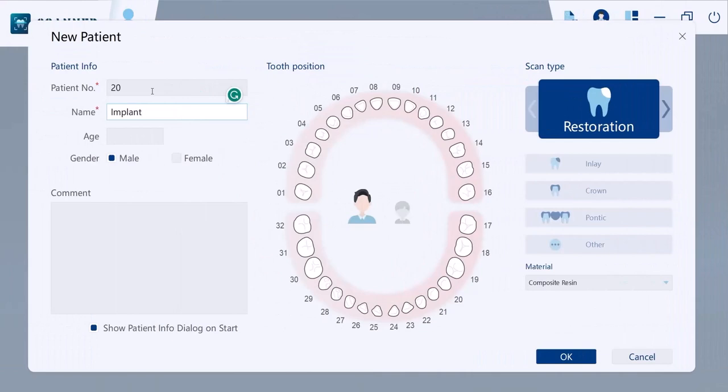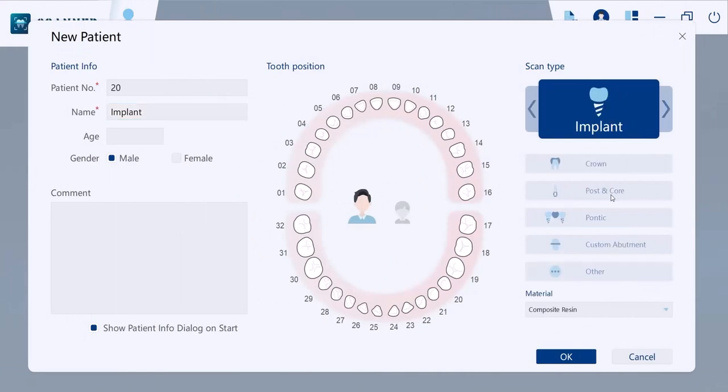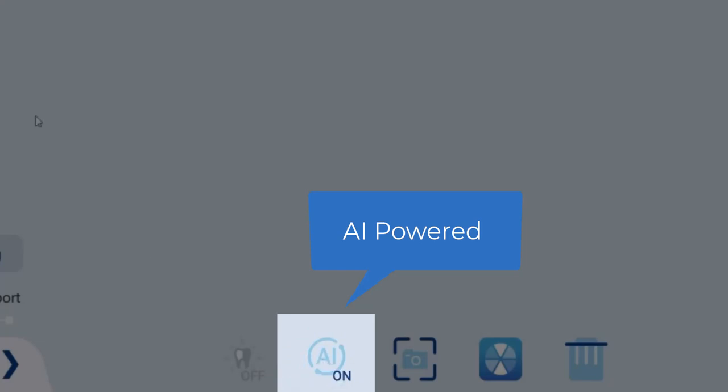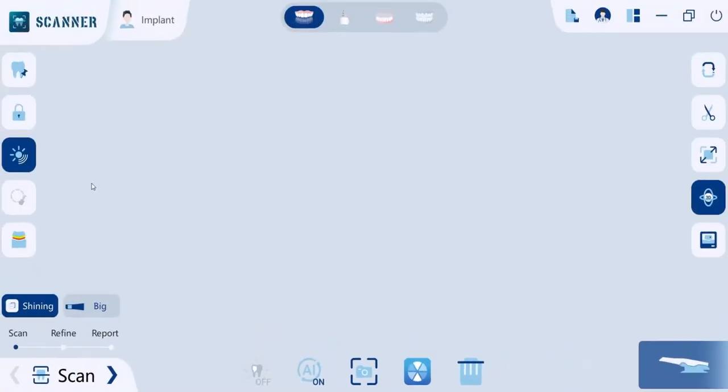Returning to the software interface, where you can seamlessly save your patient's data and choose whether your workflow is a restoration or an implant. Before you start scanning, here are some features to explore. Our software is powered with AI to remove unnecessary data like tongue and cheeks. Just make sure that it's turned on before scanning.